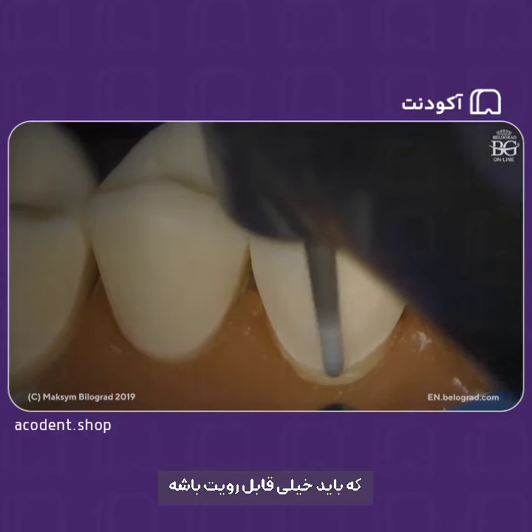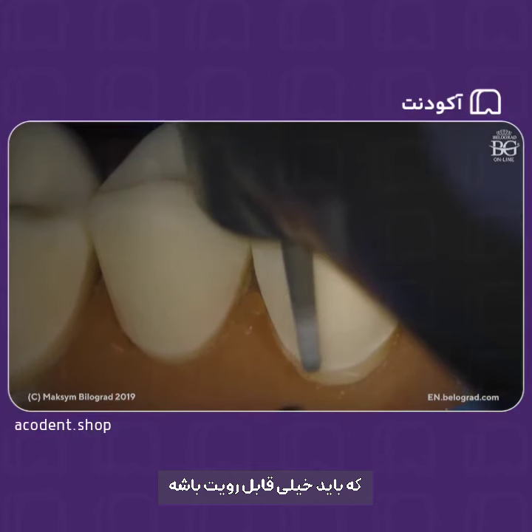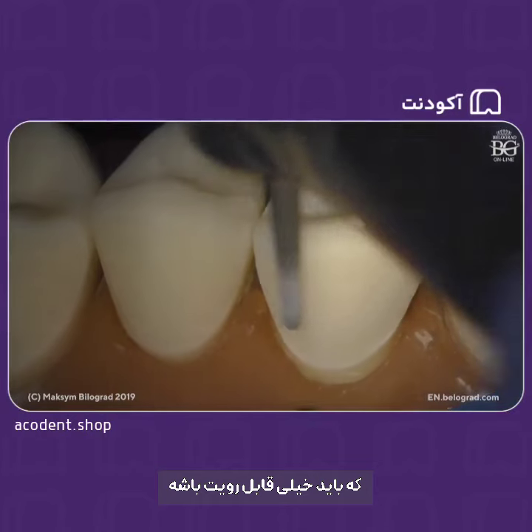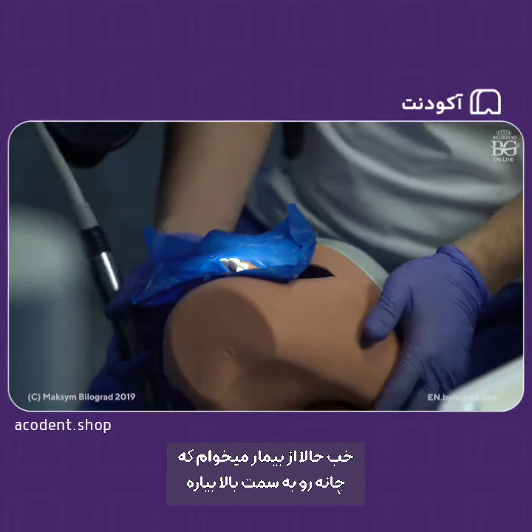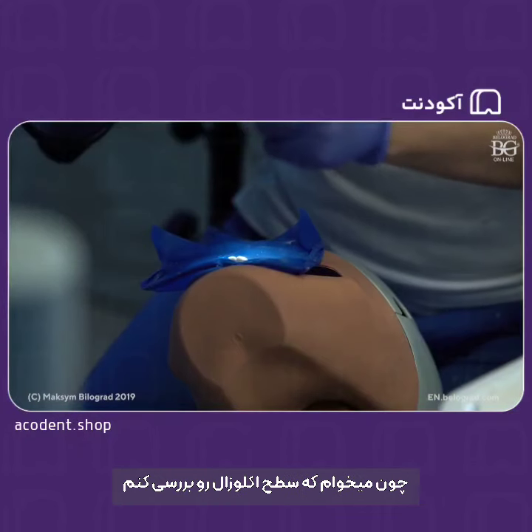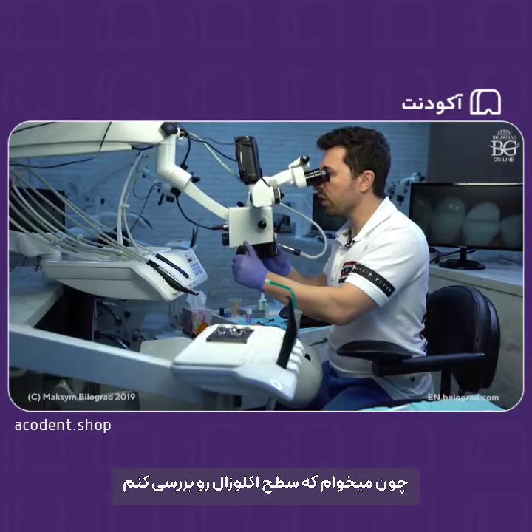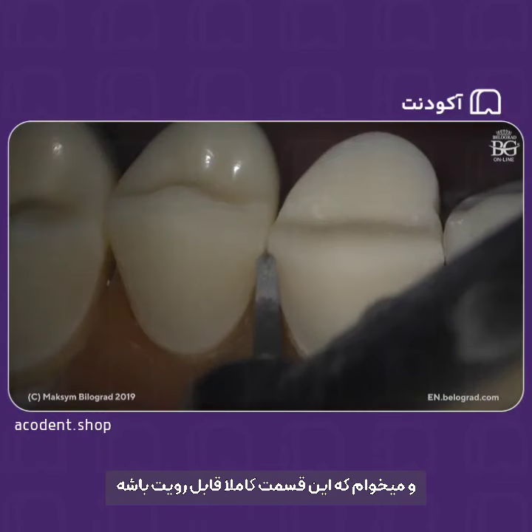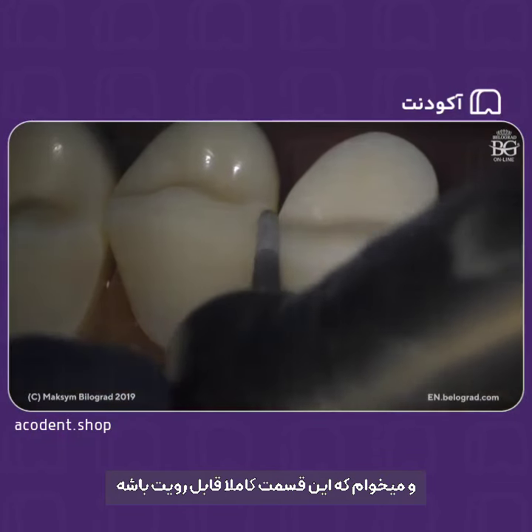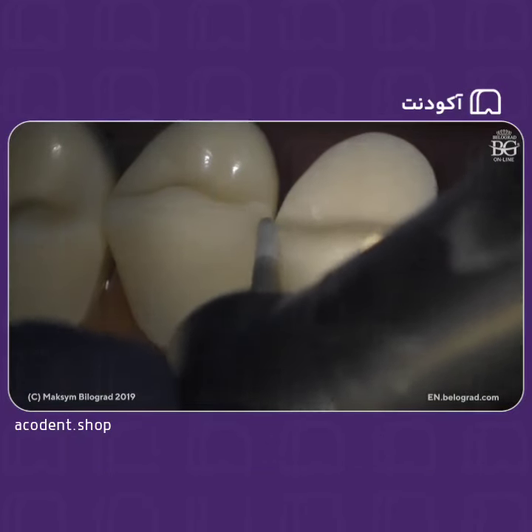That transition has to be super visible and fine. Okay, so let me ask my patient to move chin up, because I would go to occlusal and I would like to get this part visible.